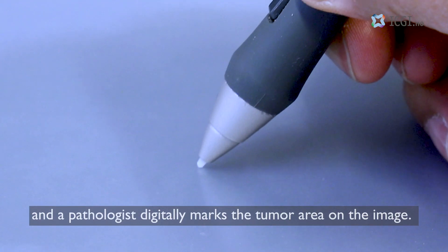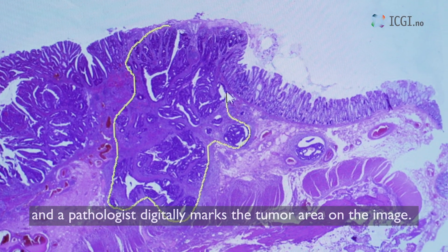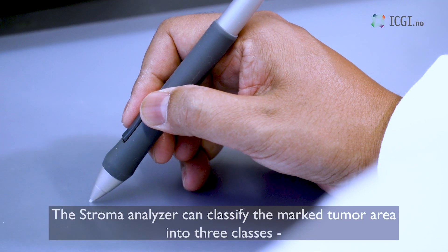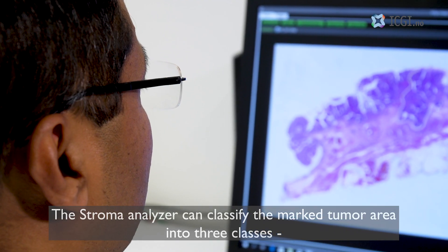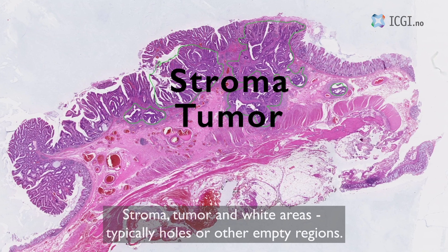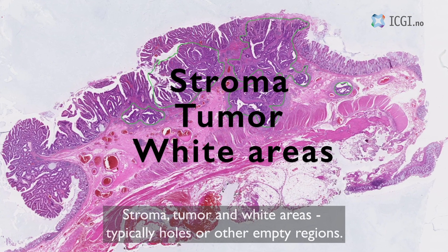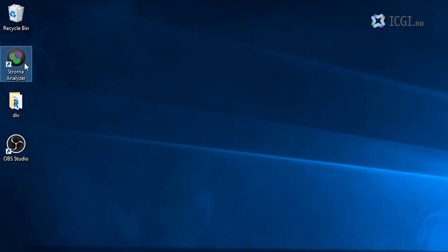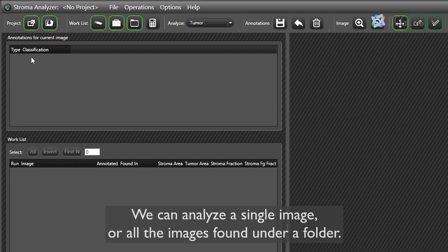The H&E stained section is then scanned, and a pathologist digitally marks the tumor area on the image. The stroma analyzer can classify the marked tumor area into three classes: stroma, tumor, and white areas — typically holes or other empty regions.